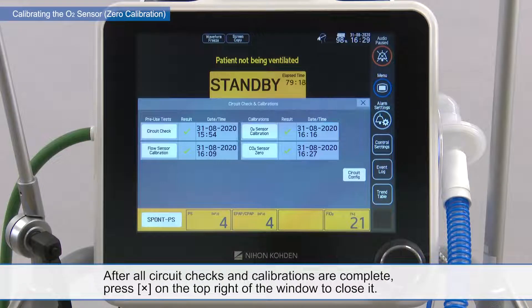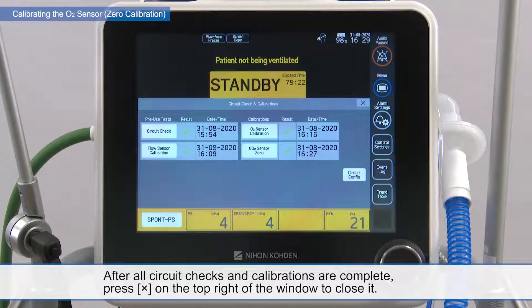After all circuit checks and calibrations are complete, press X on the top right of the window to close it.